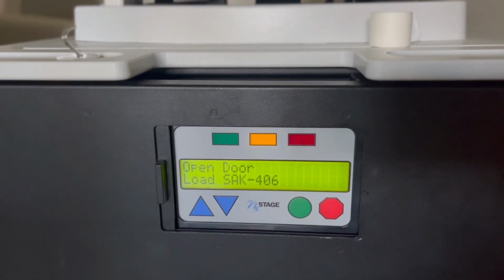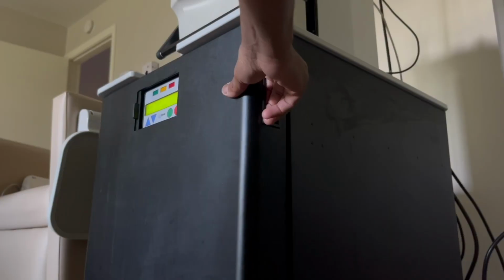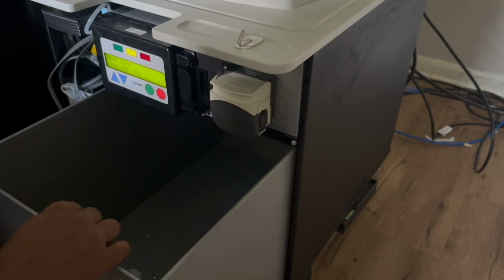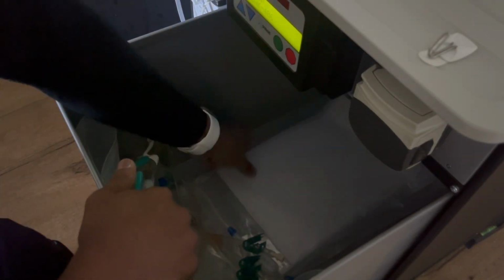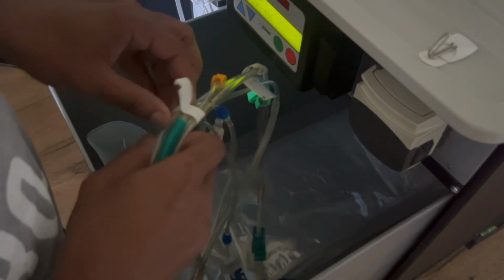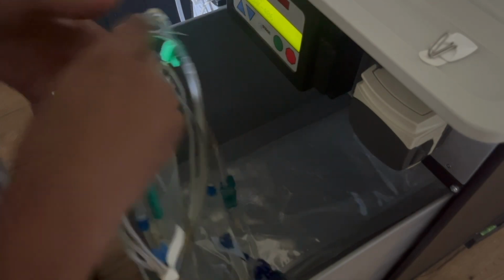Alright, so the control panel now says open the door, load the SAK. So we're going to open the outside door first, and then we're going to open the tub. As you can see, the tub is really wide in there. You're going to put the SAK in, the label towards the back, and you're going to open up the bag. Take all the stuff out. Well, it's just a little plastic thing. Take your tubes out. Take the paper tapes that hold the tubes together out.